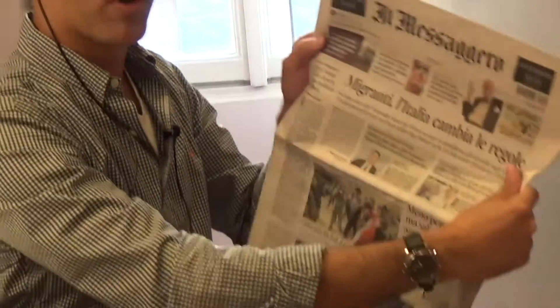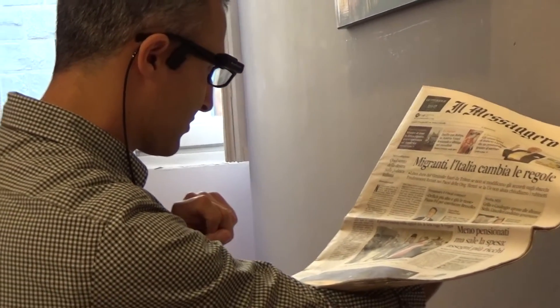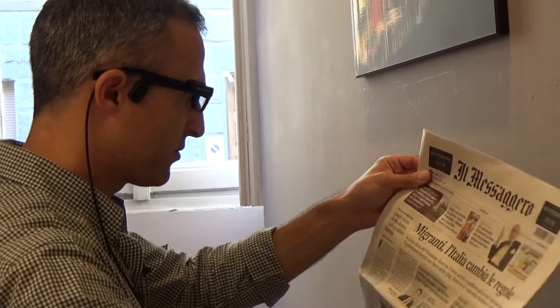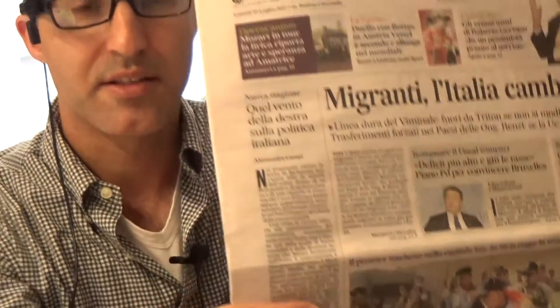I'm going to show you now how to read with OrCam. This is a newspaper, and I'm going to show OrCam where I want to read by using a pointing gesture — exactly where I want to read on the newspaper. It's reading right here right now. To stop OrCam, I can do a stop gesture like this — just by doing this, OrCam stops reading.